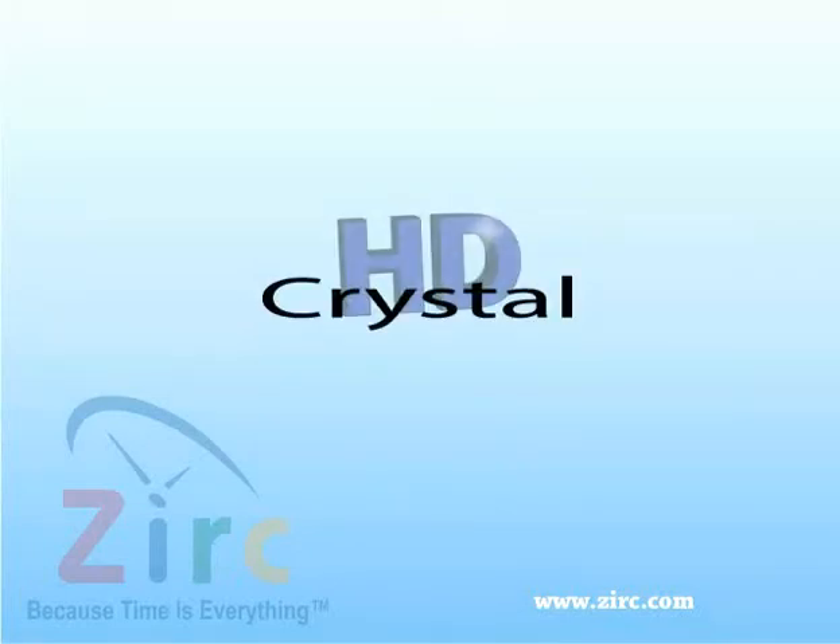Zirc's Crystal HD Mouth Mirror. Zirc is the first company in over 40 years to design a new mouth mirror. The Crystal HD mirror is one of a kind and has many great benefits.